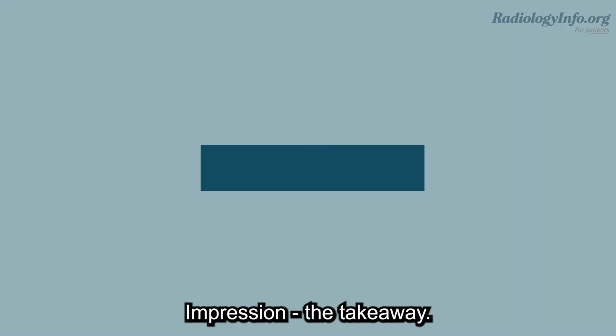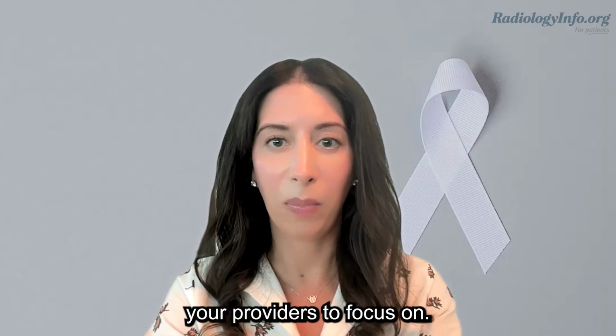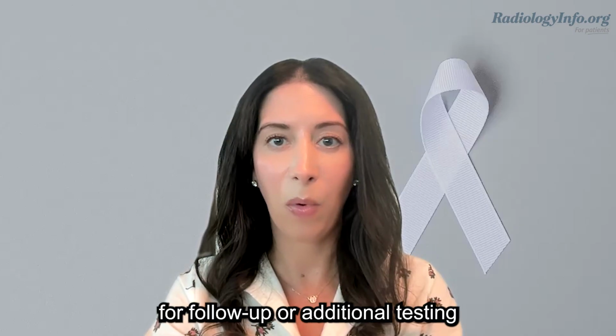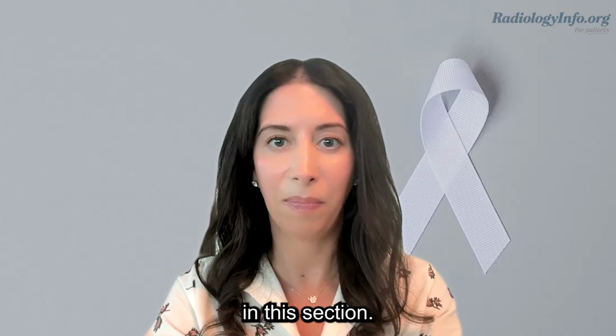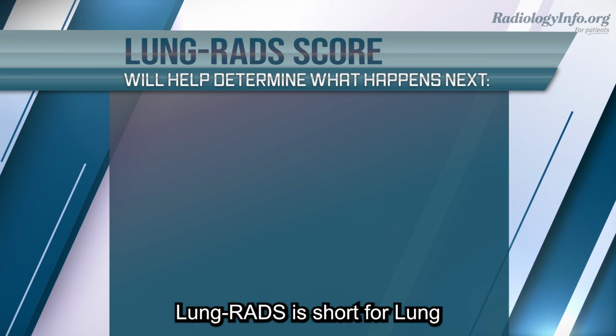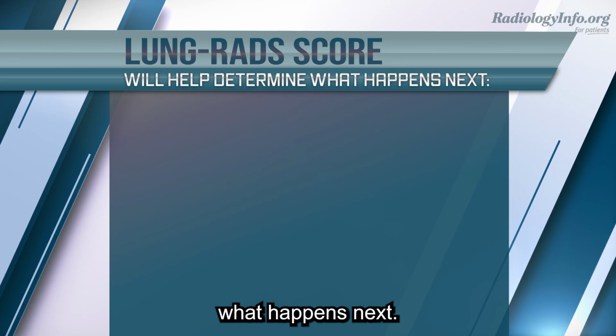Impression, the takeaway. This is the radiologist summary. It's what we want your providers to focus on. We often give recommendations for follow-up or additional testing in this section. You'll also see a LungRads score. LungRads is short for Lung Imaging Reporting and Data System. This score helps determine what happens next.